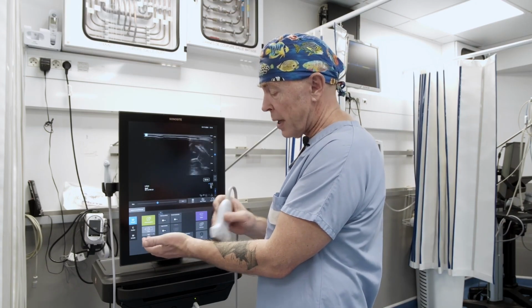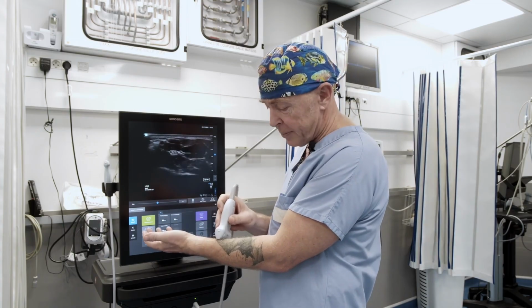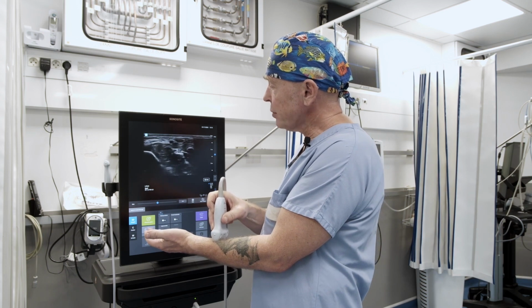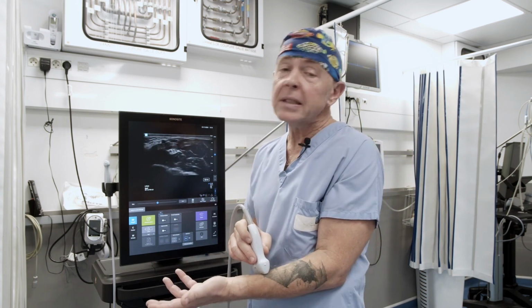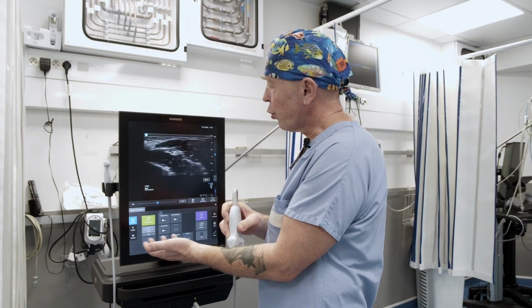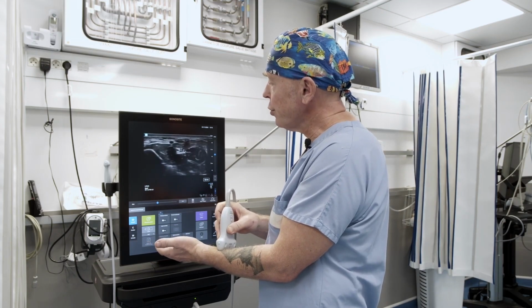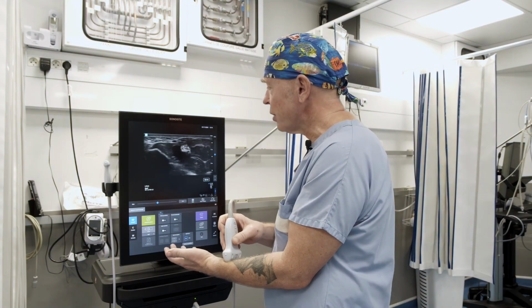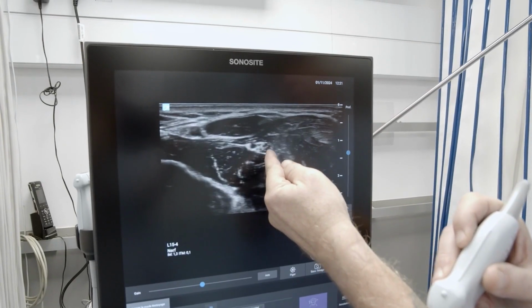Therefore, you must become accustomed to recognizing and selecting the optimal image through subtle tilting adjustments. You may also enjoy experimenting with horizontalizing or verticalizing the image. Most importantly, in your everyday practice, it is crucial to be capable of dynamically following this structure. The workshop fundamentally involves meticulously following the structure and ensuring it remains centered on the screen. This is precisely what you will consistently do each day in your practice of ALR blocks. You accurately identify the structure, and here we have it distinctly.